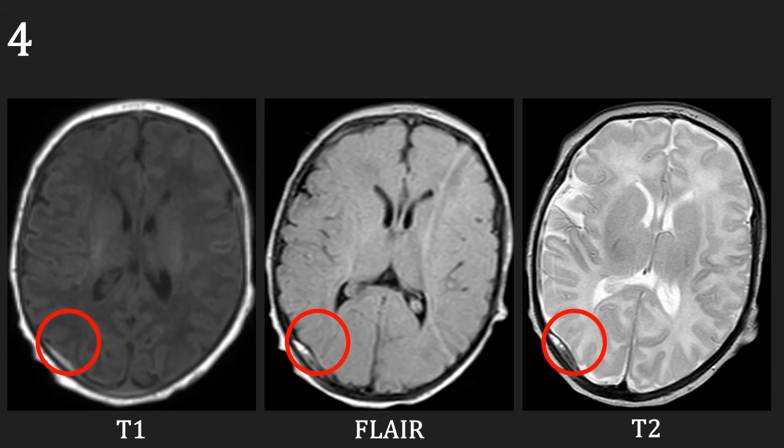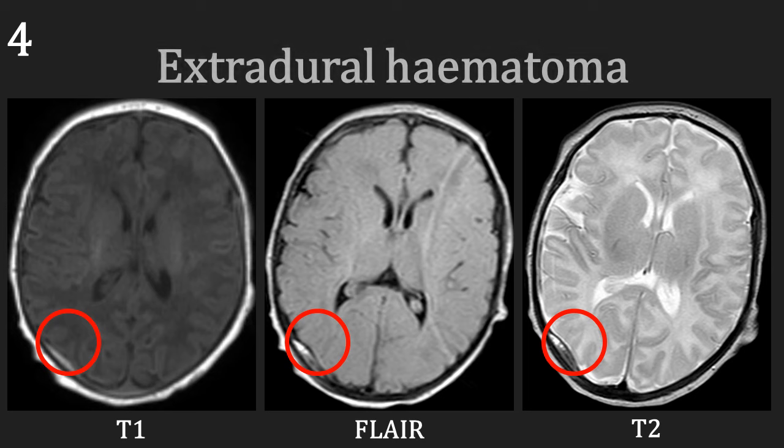This newborn baby was imaged because of a difficult vaginal delivery, initially attempted with forceps then converted to caesarean, and the clinical team were concerned about increasing head circumference. A previous CT had shown a right parietal skull fracture and an extradural haemorrhage. The MRI confirms this with a biconvex area of signal abnormality in the right parietal region. This is an extradural haematoma.